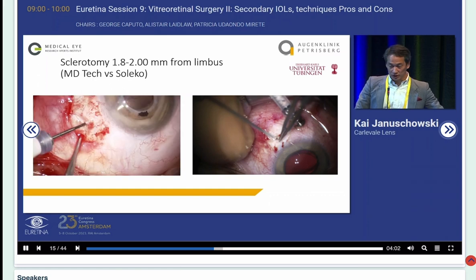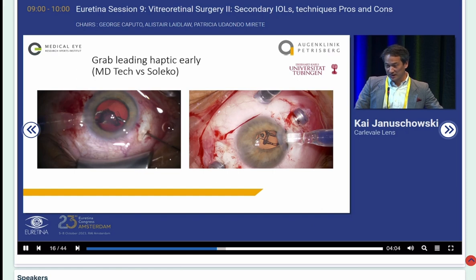Now, what is also very important for me, what helped me quite a lot, because let's be honest about those anchors. Those anchors will break and it will have you frustrated. And once you manage this situation where the anchor doesn't break, and the worst thing is that the second anchor breaks, and then you have to take out the lens and or suture the lens entirely.